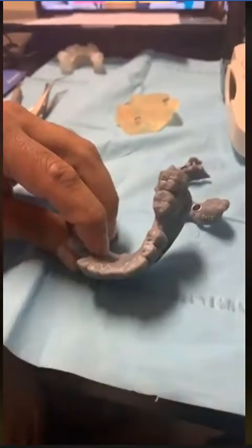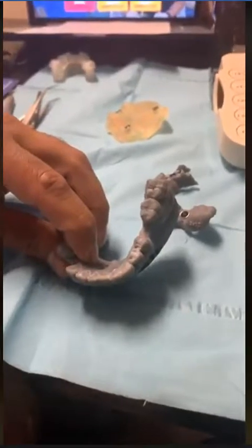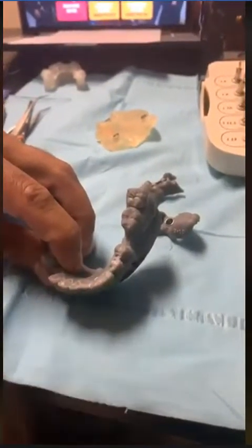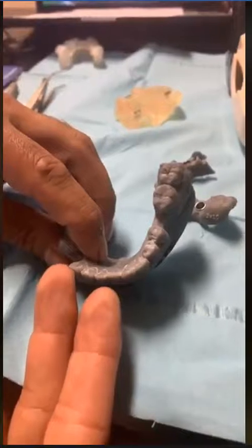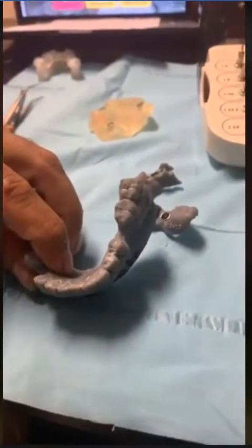Get a perfect look of exactly what it's going to look like once you finish, and then compare that with your surgery on a live patient after you're done. So this is a good practice for those of you who are starting to use guided surgery, to recognize exactly how this is going to work, and whether you were able to translate what you did on the model into the patient's mouth.